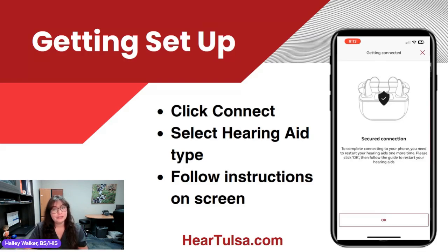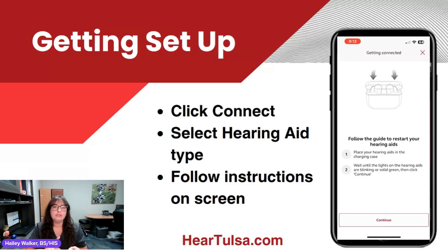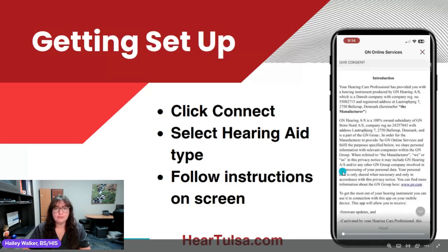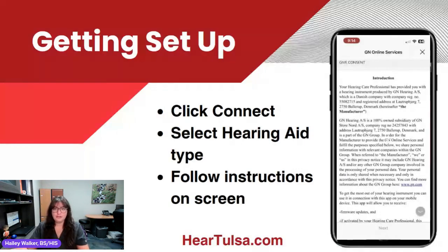Once we go through, it'll have you put them in the charger or replace the battery, just to get that final connection between the hearing aids and the app. After you go through that, it'll prompt you to accept or decline the GN online services. This is where you have the ability to receive the programs and setups from your hearing care professional if they have that option for you.